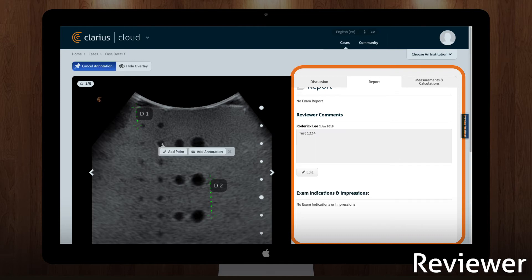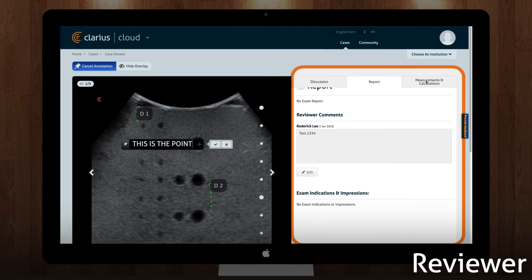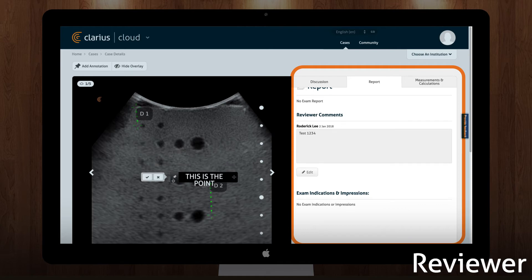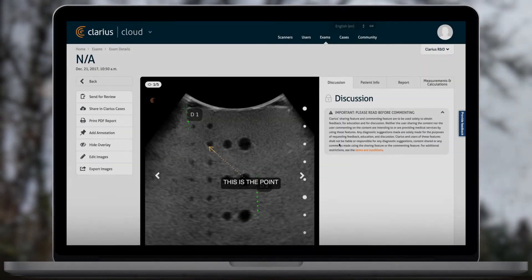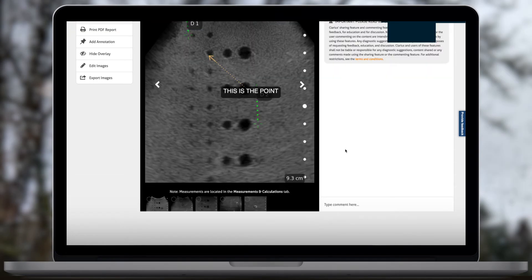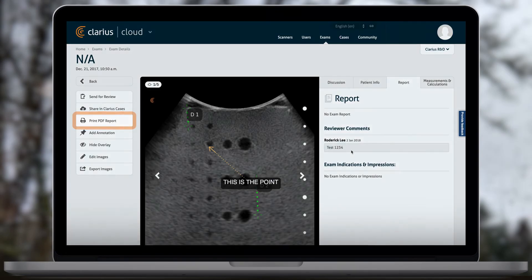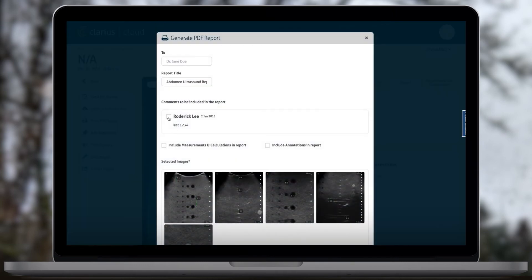Click on Report to submit your diagnosis for the exam creator. You can have a discussion with the exam owner and other reviewers by posting comments. You can also add annotations to the image. Once you are ready to create a PDF report of your exam, click on Print PDF Report. You can choose which reviewer comments to include in the report, as well as any measurements, calculations, or annotations.